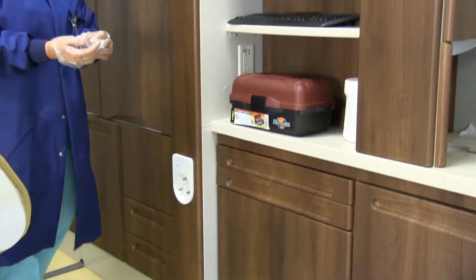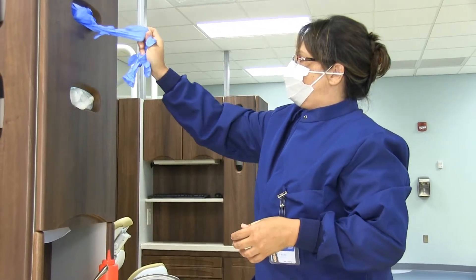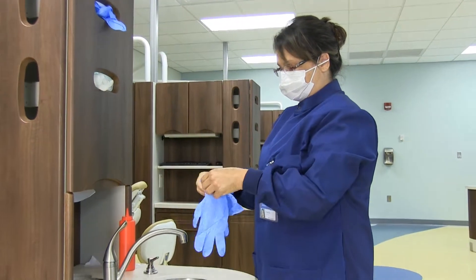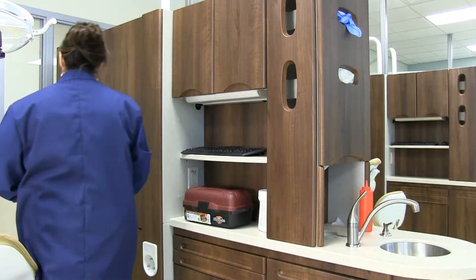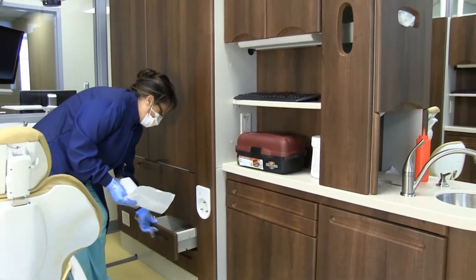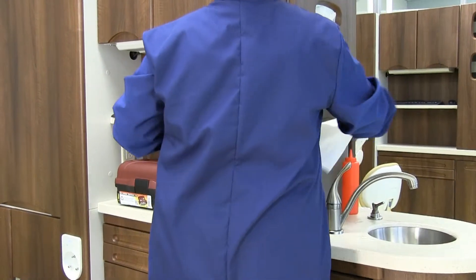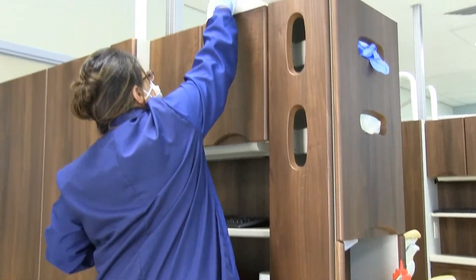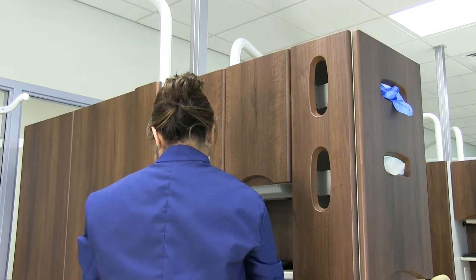Then wash hands using the two-cycle method. Place on treatment gloves, followed by over gloves. Take four paper towels. Place two in the supply drawer, and place two, along with an extra pair of over gloves, on the cabinet shelf above the computer keyboard.